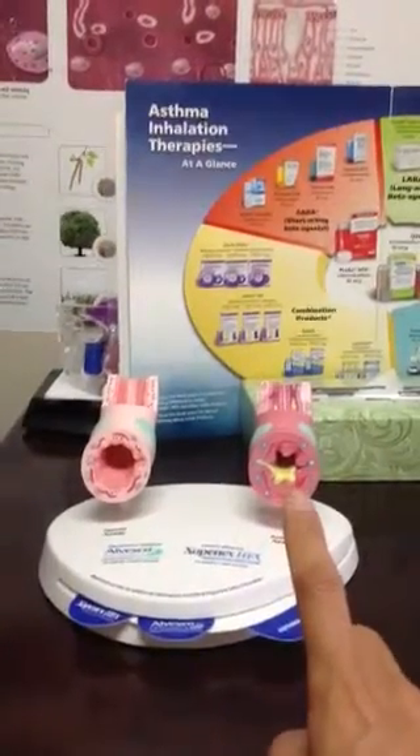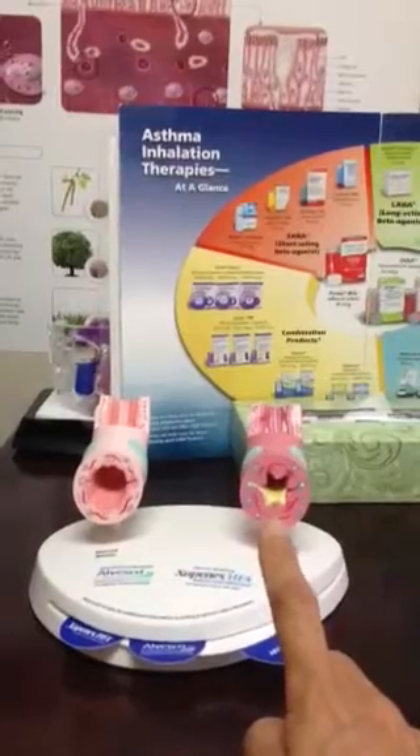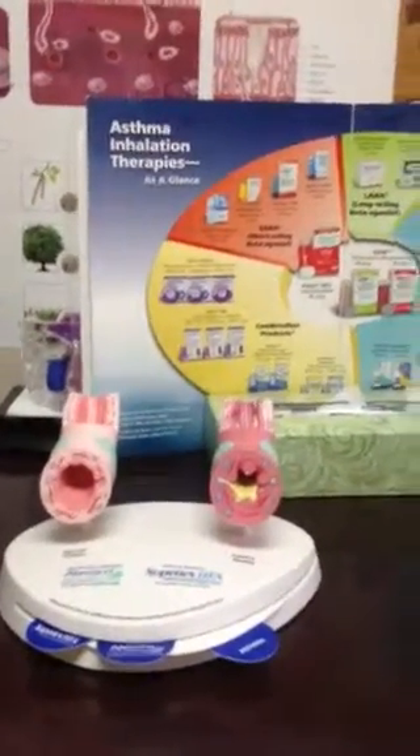much tighter airway with a lot of phlegm or inflammation showing as yellow in the middle. So if you can imagine, it's much harder to use an inhaler as it is, but when you're having asthma and your airway is quite obstructed or narrowed, it's much harder. It's extremely important to do the few little things necessary to get the inhalation in correctly.